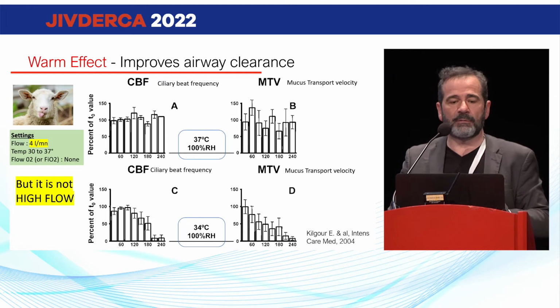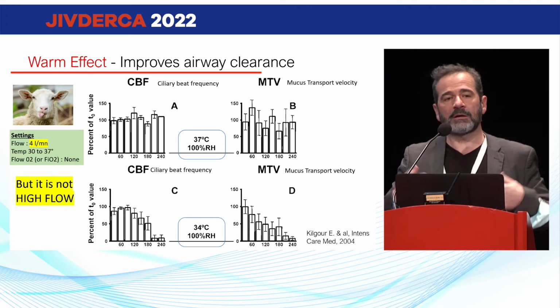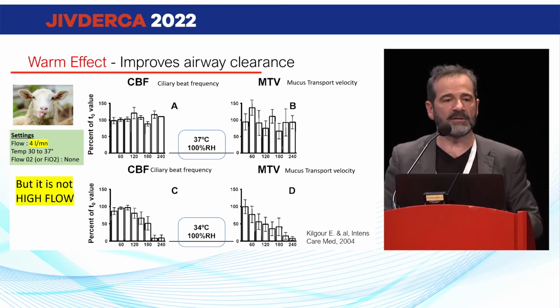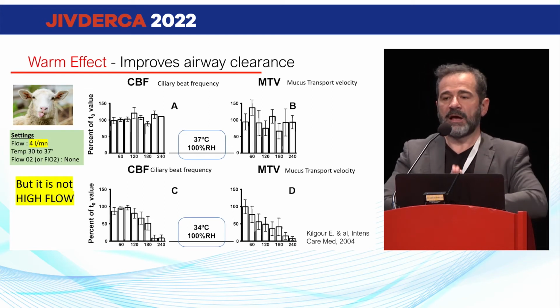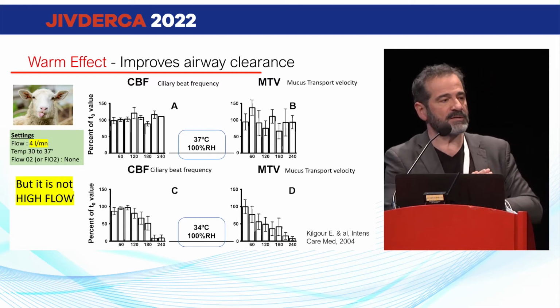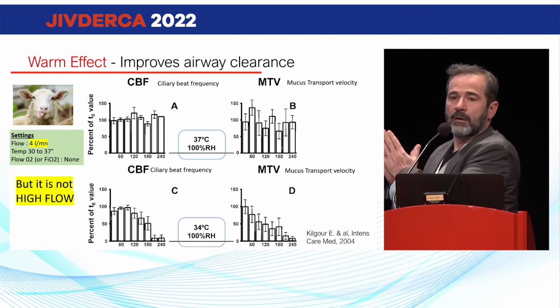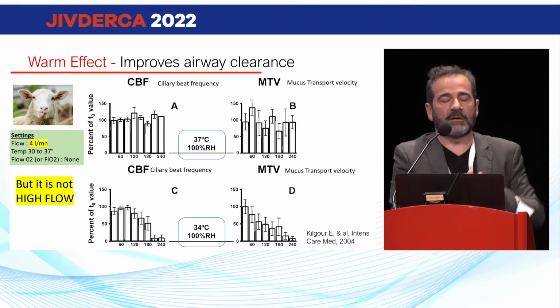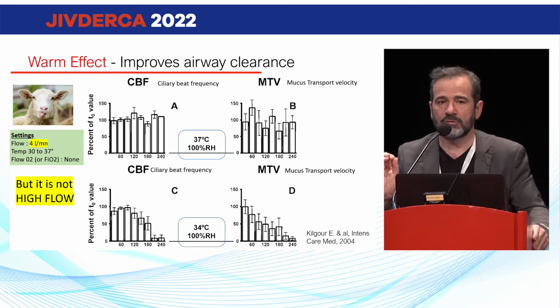It's not very different. And the red line I want to give you to read, sorry for that, again and again and again during these 3 days, is the same studies. I want you to look at the methodology of these studies, and especially the settings of the device. The setting of a device is going to explain everything, because sometimes you are going to have one type of effect, the warm air, the humidification, and another time you are going to have another effect, the effect of a flow. Let's start with each one.